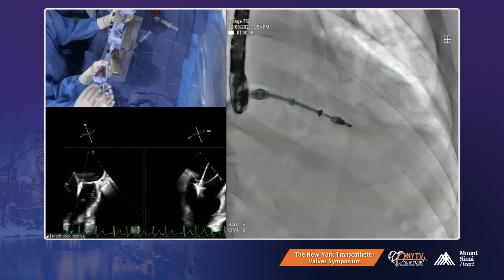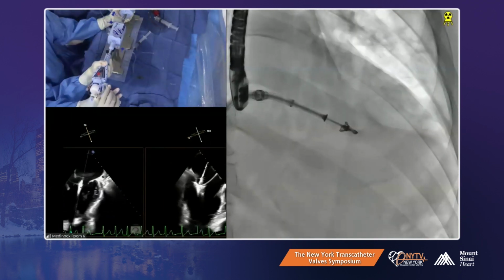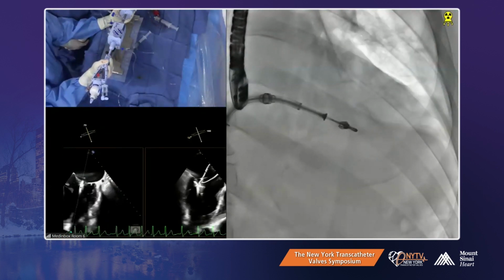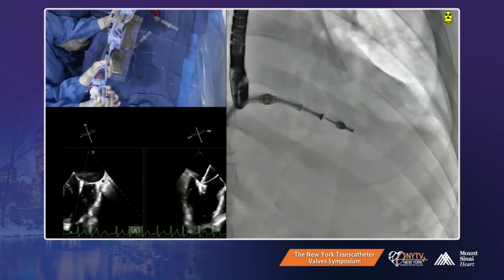Now, they're giving the Cardizem drip now. No, he's asking, do we have Esmolol drip going? Take it off. You have anterior leaflet. Lift it. Why don't you try to go clockwise a little bit? We tried. We'll try again. Digoxin will help also. 0.25.